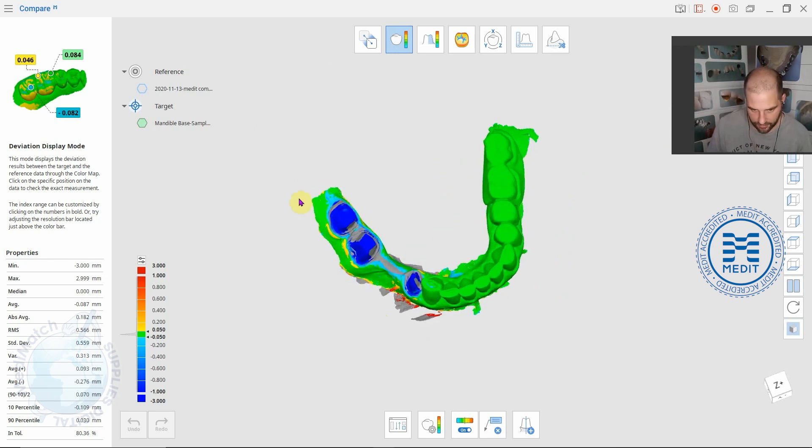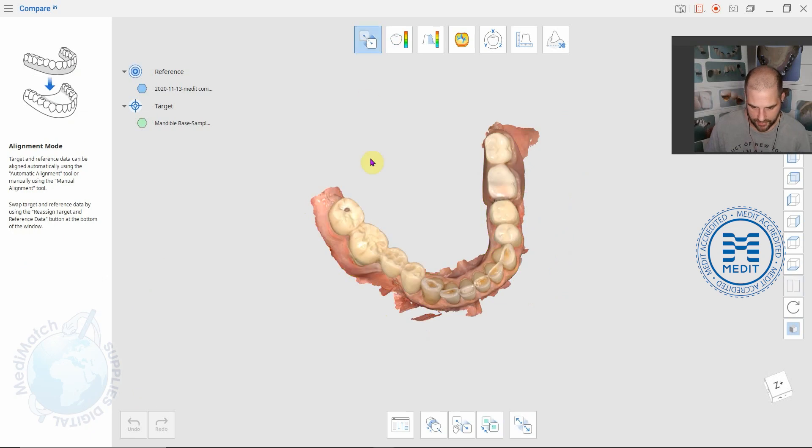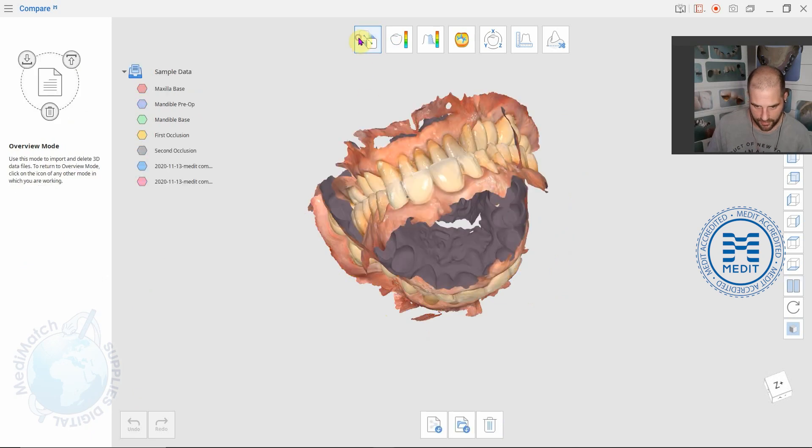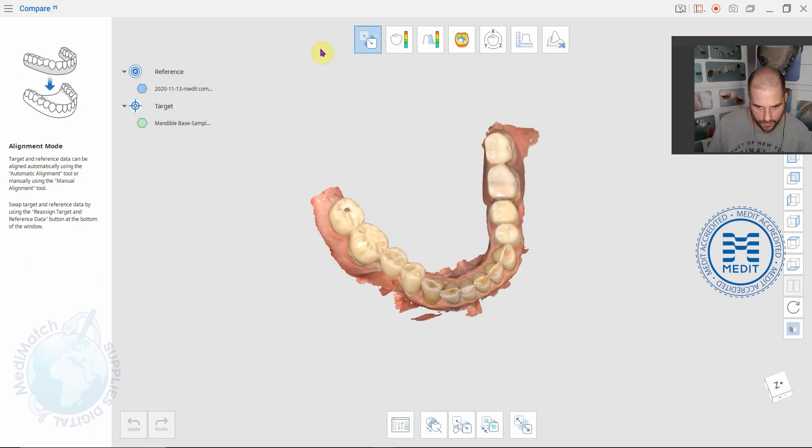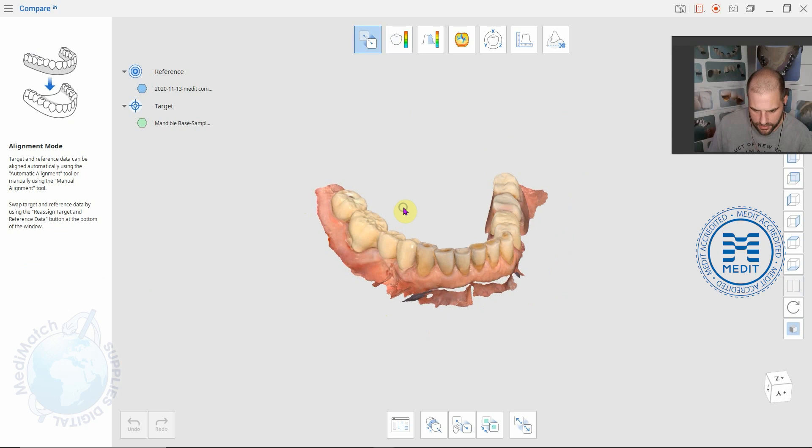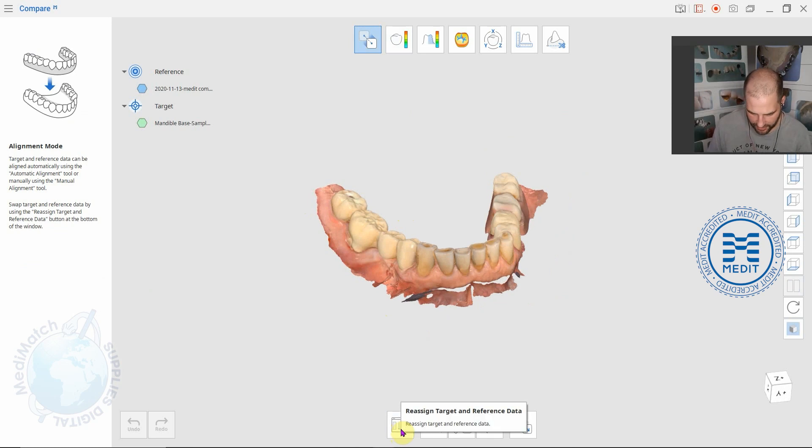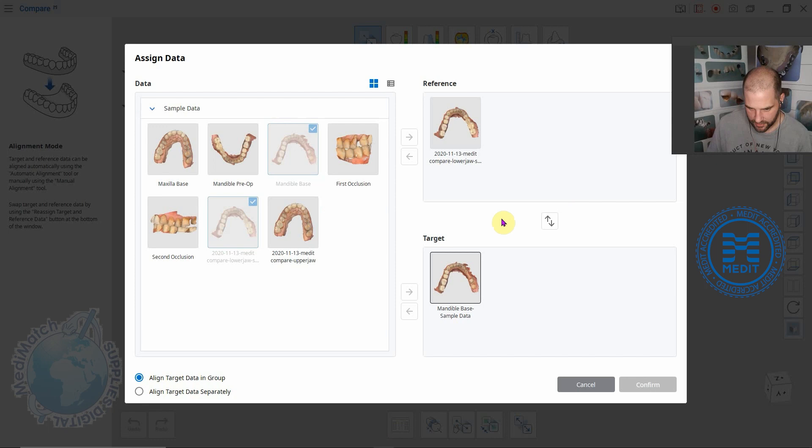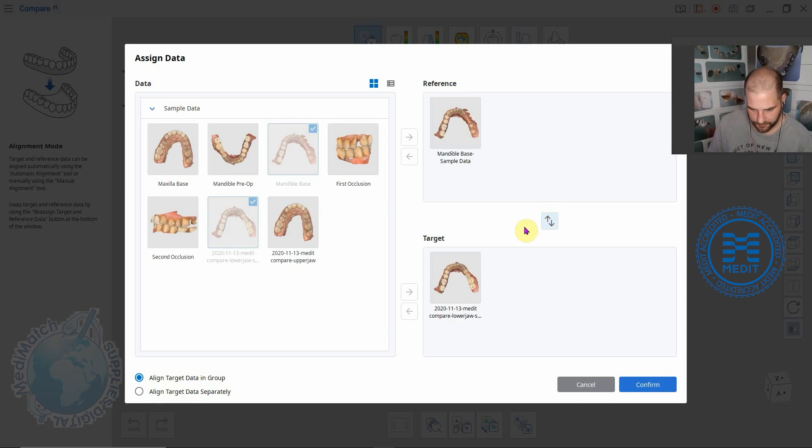If we go back into here and we click, I want to change down here, reassign target and reference data. If we switch them the other way around now and click confirm.